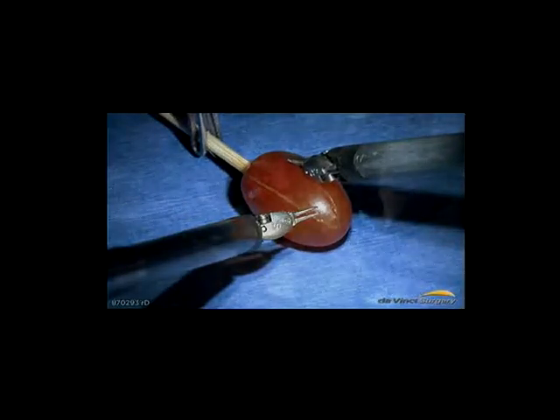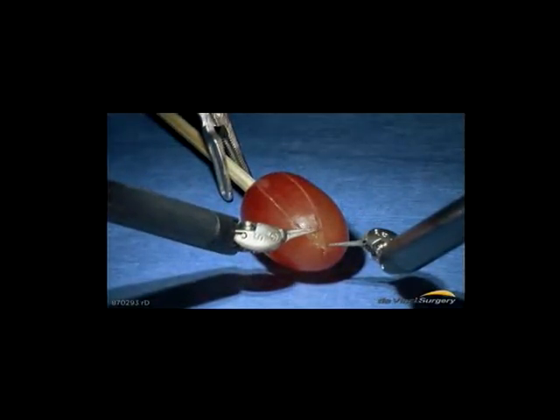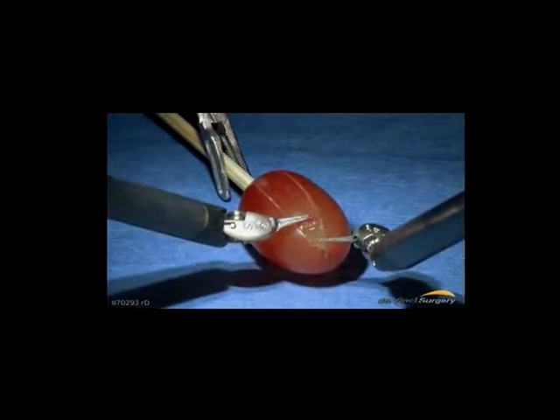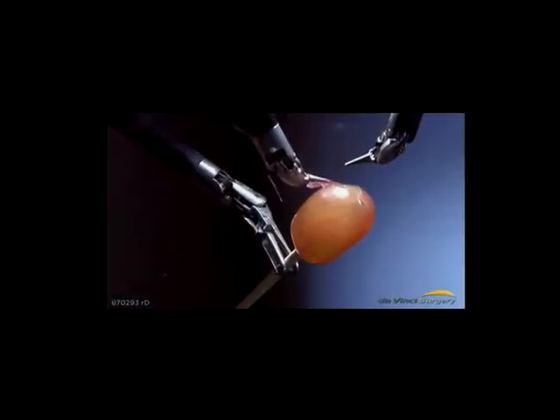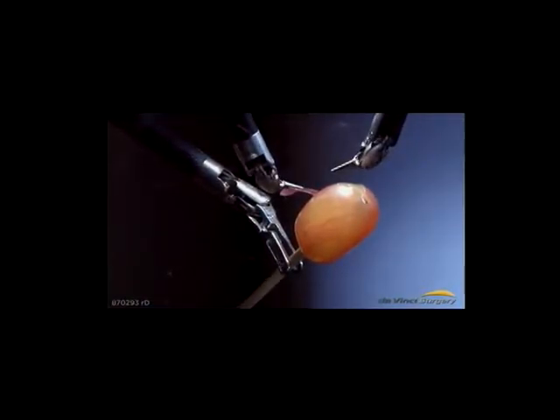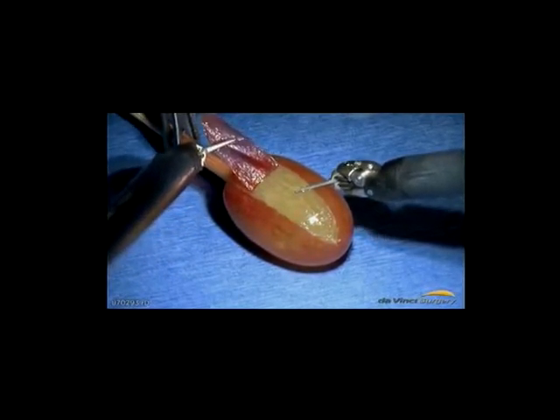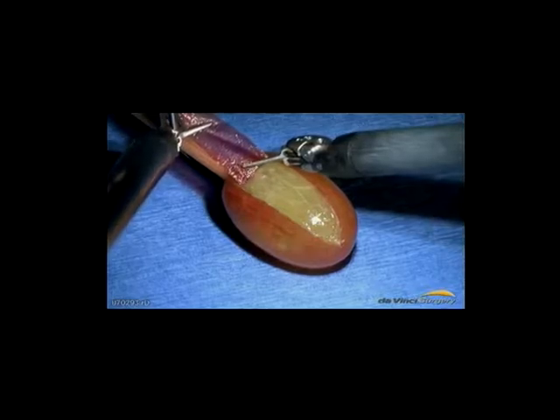Now, Dr. Allison Robinson, Northern Inyo Healthcare District's colon and rectal surgeon, explained the Vinci system builds on the 1980s idea of minimally invasive surgery. Much like its predecessor, laparoscopic surgery, robotic-assisted surgery allows for smaller incisions, less pain, and the press release notes even faster recovery.